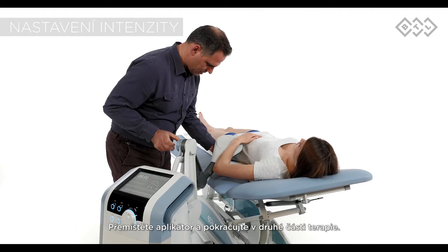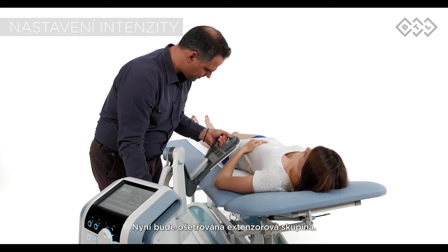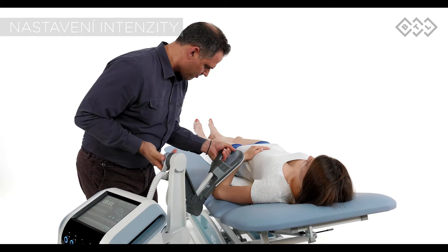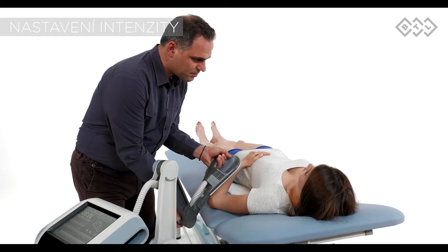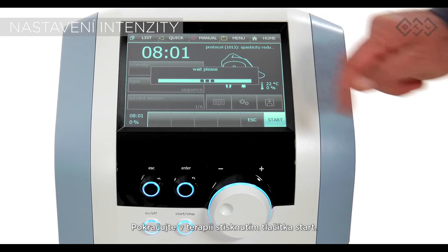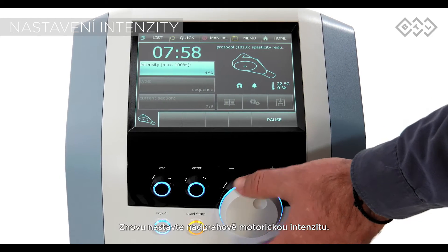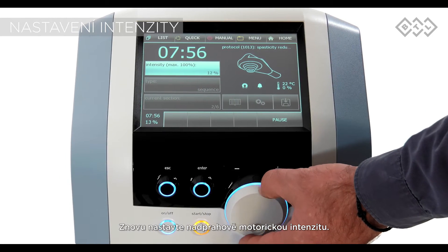Reposition the applicator for the second part of the therapy. This time, the antagonistic extensor groups will be treated. Continue by pressing start and initiating the therapy again. The intensity has to be set again to above the motor threshold.